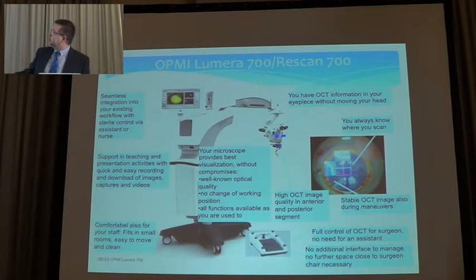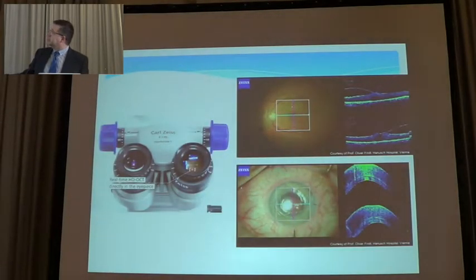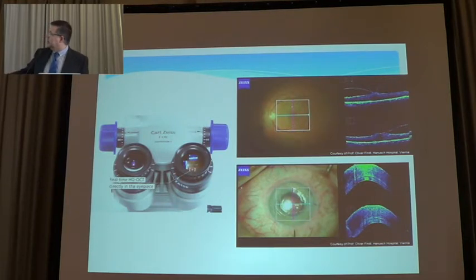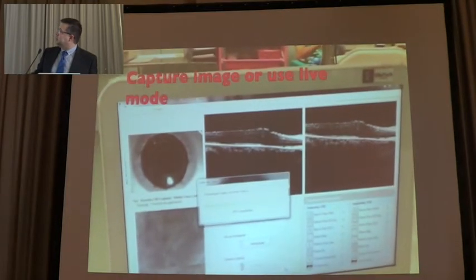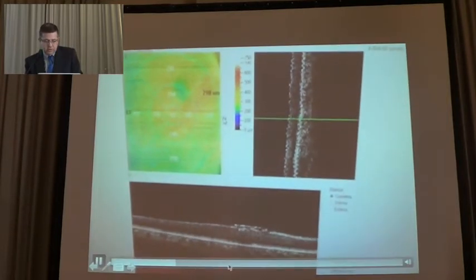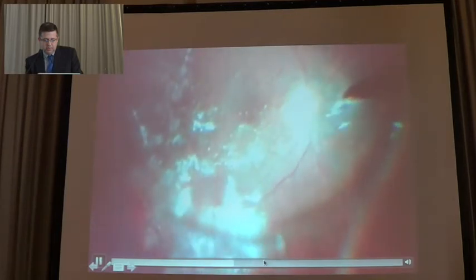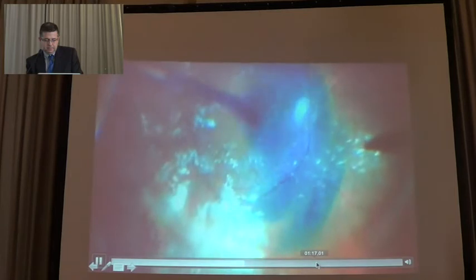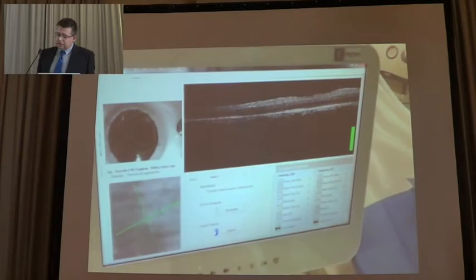This is the ISITE system — the system integration is displayed on the screen and also inside the eyepiece of the microscope. It's a little difficult to use at the beginning, but you can have the overlay inside or outside and eliminate the image from your microscope view. It's very useful to know if the lamellar cut is correct or not, and it's also useful for wound assessment. You can also use some devices intraoperatively to preview the anatomy before surgery and confirm after surgery whether everything is complete.